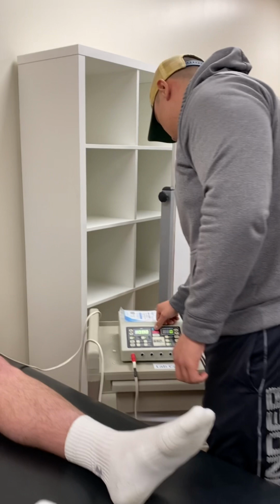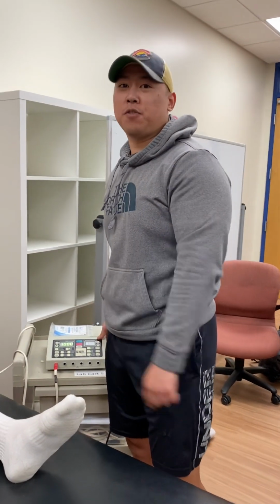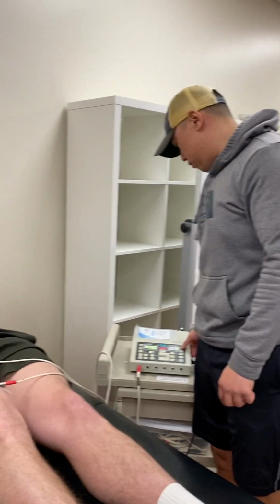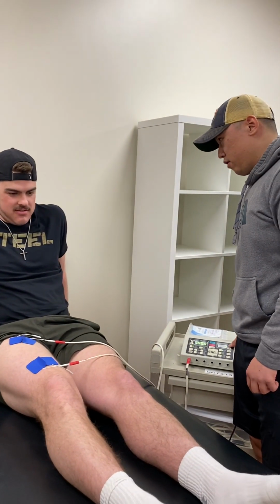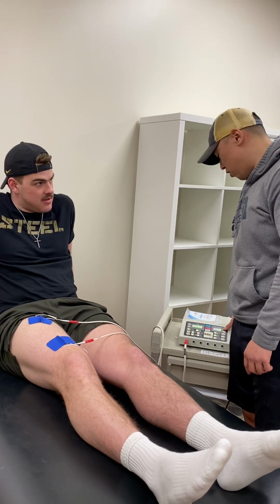I'm going to turn it on, and then the intensity is just based off what the patient can tolerate and what's comfortable to them. So just tell me when you start feeling it. I'm starting to feel it. Keep going. It's just kind of tingly right now. You can keep going. Just tell me when it starts feeling intolerable.